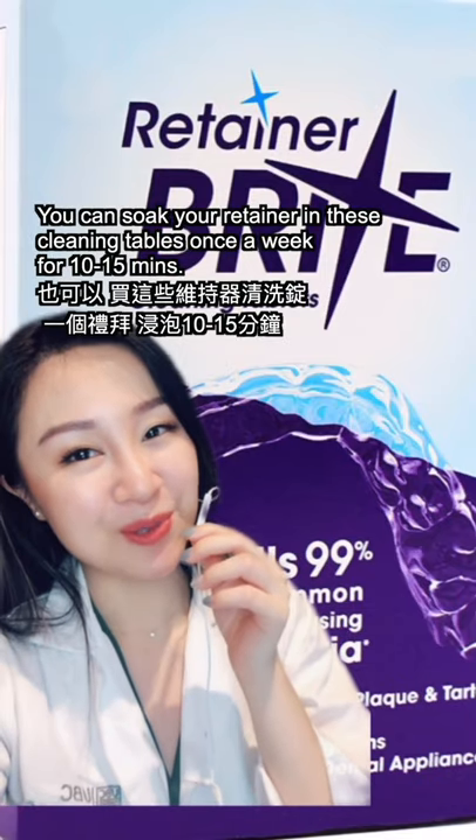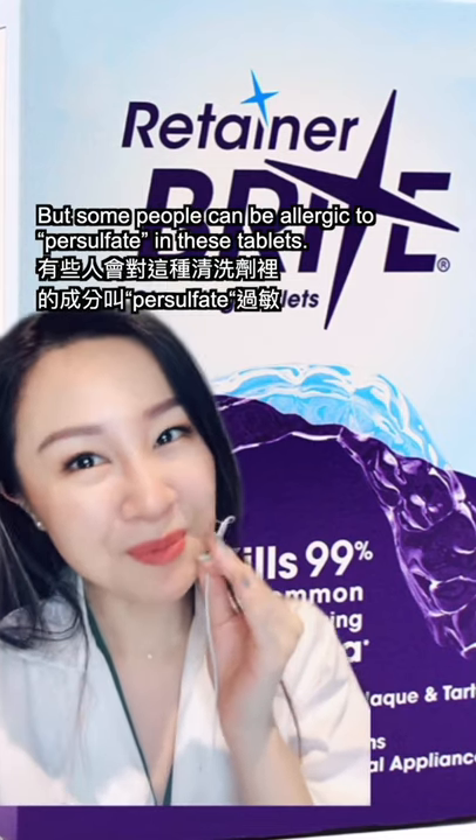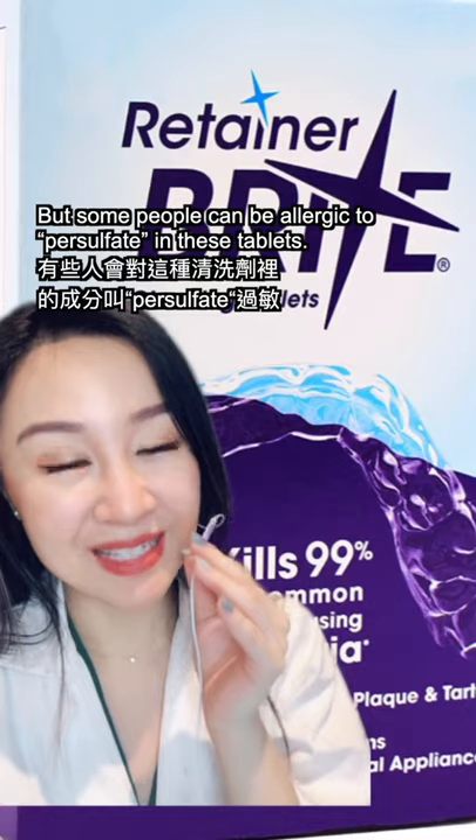You can get cleaning tablets from the drugstore. Soak your retainer in this solution for 10 to 15 minutes a week. But some people can be allergic to an ingredient called persulfate in these tablets.